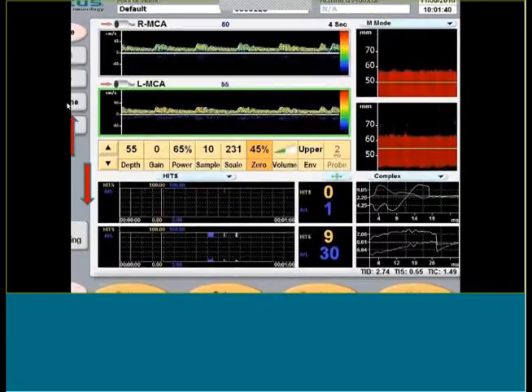And I apologize, the slide is cut off, but here's your baseline button, and here is your recording button right here, and then there's a little green button here. I like the M mode because it's showing I'm in the middle. That's very important. Okay, so here's 40, 50, 60.